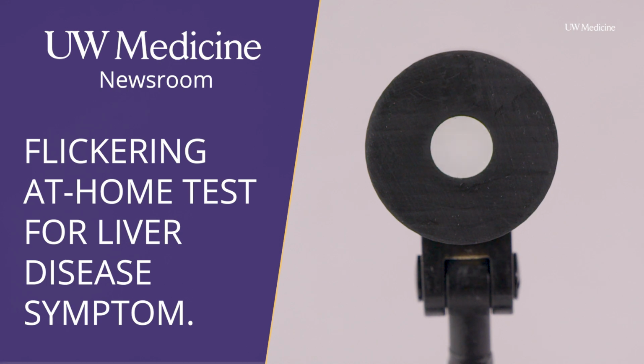A device that uses flashes of light to detect a byproduct of liver disease is being tested at UW-Medicine. The purpose of the flicker device here is to enable us to provide patients with a tool that they can measure for themselves at home to see if they're at risk for developing hepatic encephalopathy.